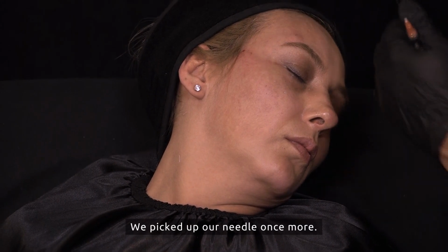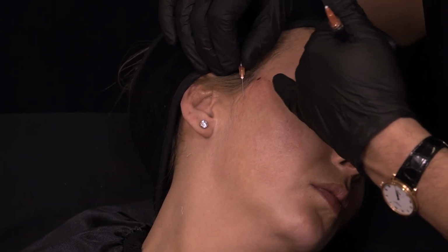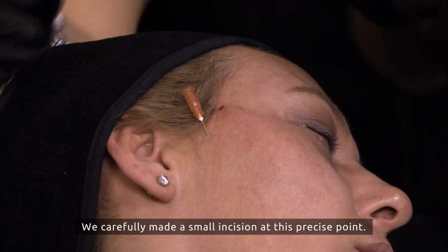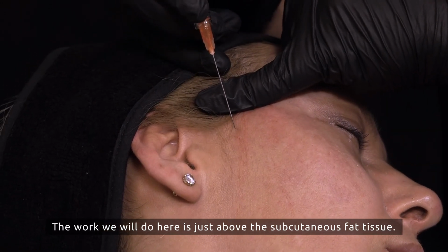We picked up our needle once more. We need to be positioned approximately a finger's width in front of the ear for optimal placement. We carefully made a small incision at this precise point. We are not in a deep layer here, friends. The work we will do here is just above the subcutaneous fat tissue.